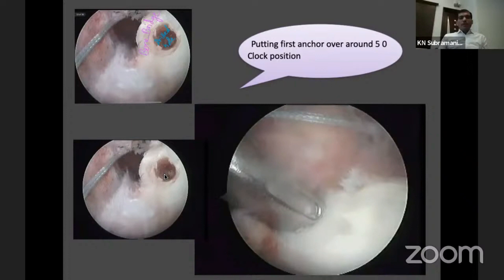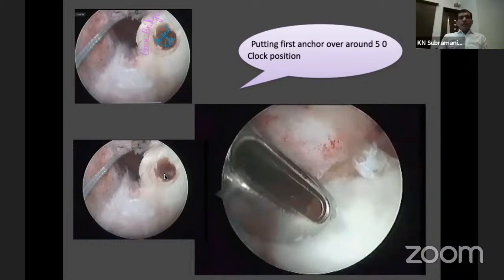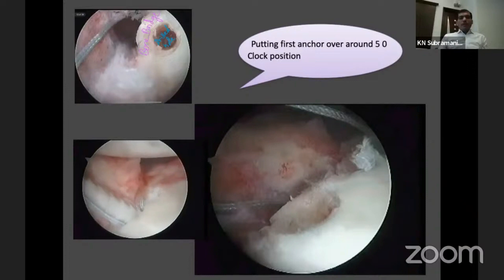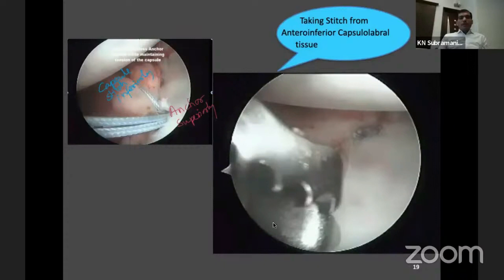Before placing the anchor, you have to make sure the tension of the anterior capsule is brought back to normal. As the anchor goes in, the anterior capsule gets tightened. This is very important — to re-establish the tension of the anterior capsule. One centimeter of capsular tissue comes closer to the glenoid and becomes tightened. That is the way you have to bring the anterior capsule proximally.